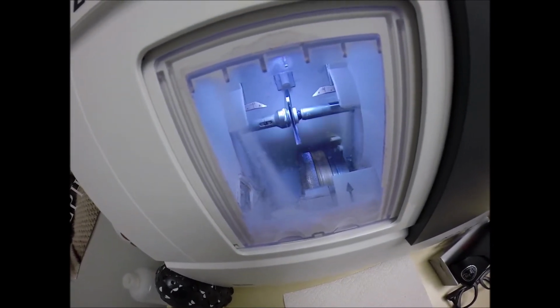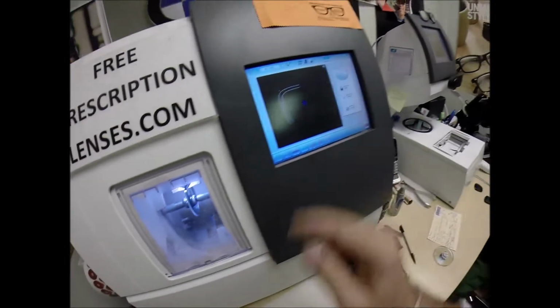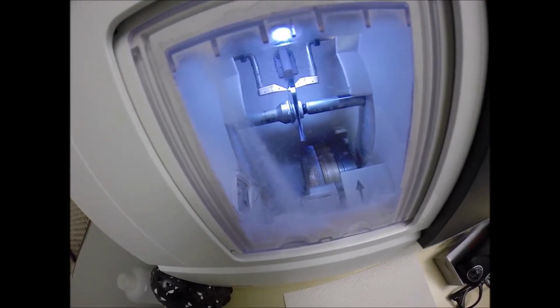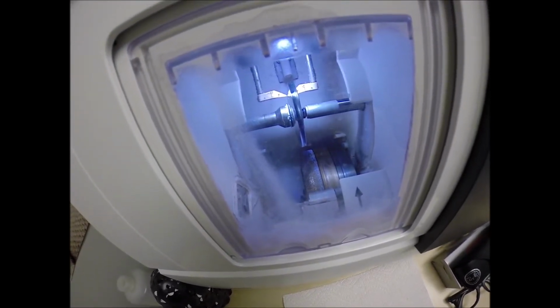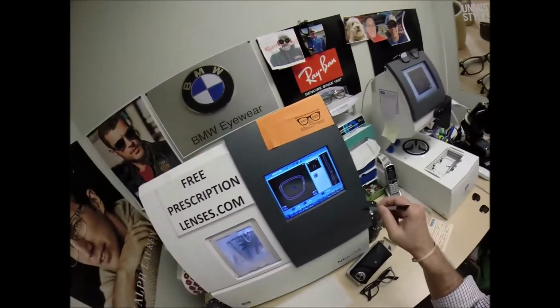The lens is going to be traced by 2 wide styluses, making sure that it's large enough to fit into the frame first go around. And you can see it's tracing the shape of the right side of the frame. And then the old carpenter saying measure twice, cut once, measuring the thickness of the lens. But I'm actually going to override it this time, and I'm going to tell it where to place the bevel.